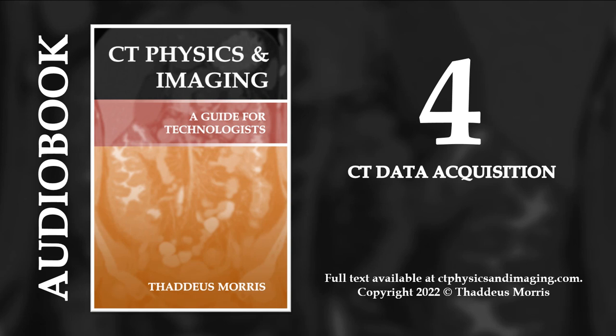The major benefit of helical scanning is decreased scan time. Axial scanning has several stops and starts, but helical scanning gets all of the information without stopping. This adds to patient comfort by reducing the number of breath holds during the scan. But the more important effect relates to contrast administration. Intravenous contrast is quickly diluted in the bloodstream and is rapidly removed from circulation by the kidneys. This means there is a very small window of time during which the contrast can be viewed in the organ of interest.